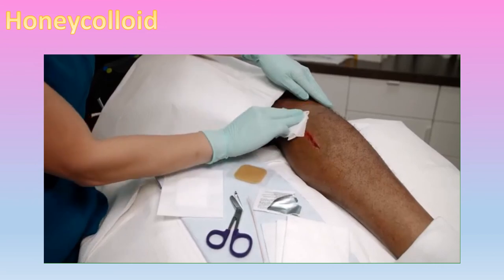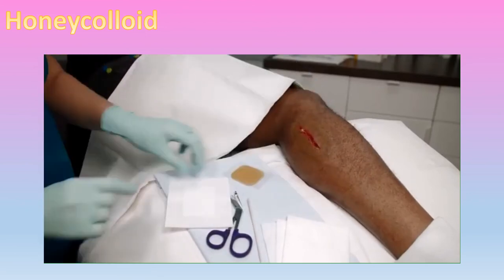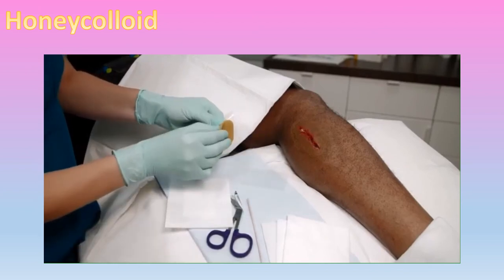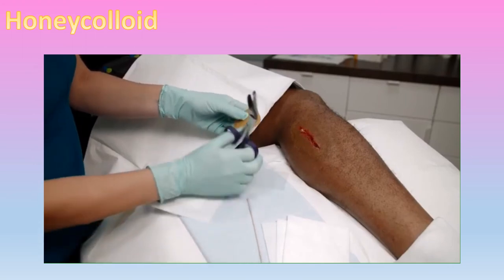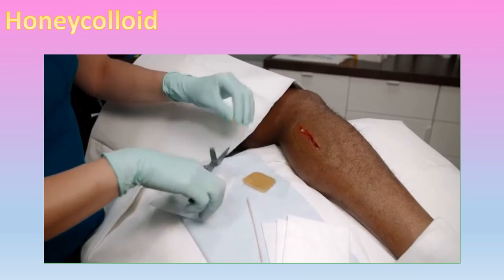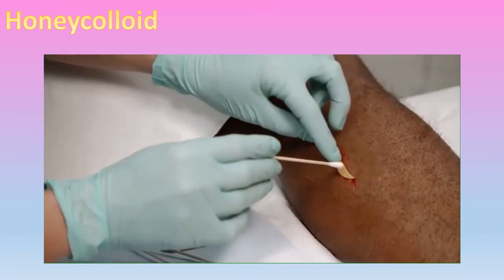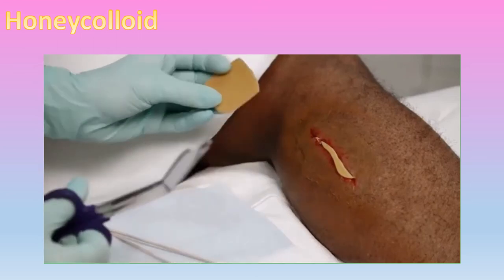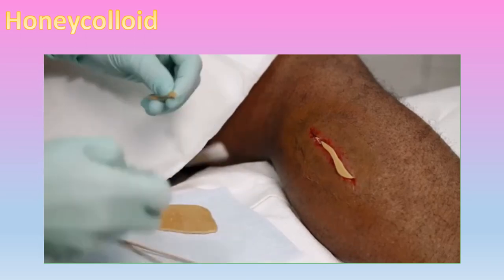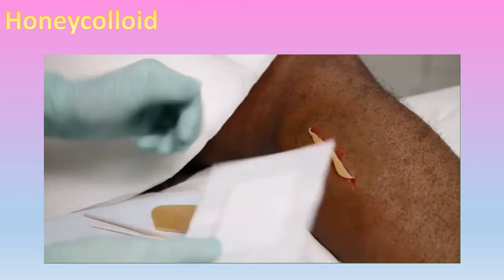After properly cleaning and preparing the wound site, we are applying Non-Adhesive Metahoney Honey Colloid to this traumatic wound. This non-adhesive version may be cut to fit into the wound bed. First, open the Honey Colloid dressing and remove the plastic film covering from the dressing. Then cut the dressing into strips that will fit into the wound bed. Once the Metahoney Honey Colloid is in intimate contact with the wound bed, you are ready to apply the secondary dressing.